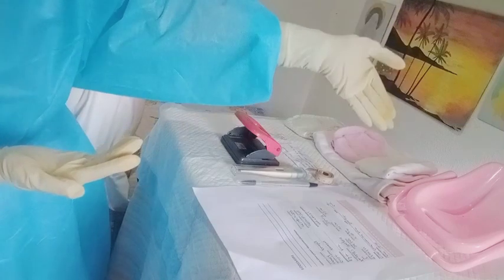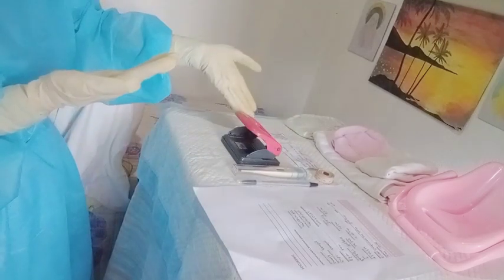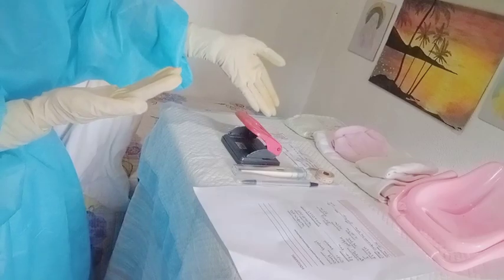Then we have here another materials such as the diaper, the bonnet, the dress for baby, and pranala. Then we also have here the weighing scale, the baby's chart, the ball pen, then rectal thermometer, tape measure, our stomach pad, the ankle band, and the identification card.